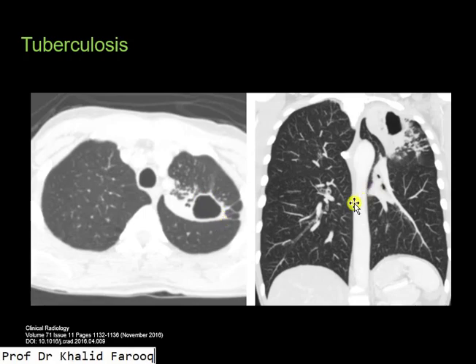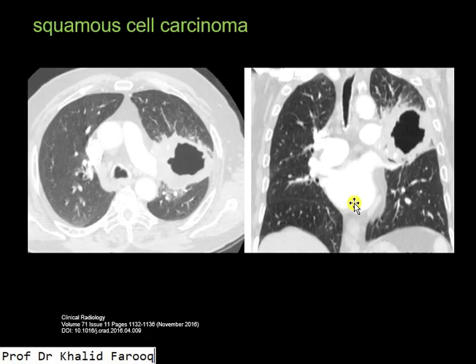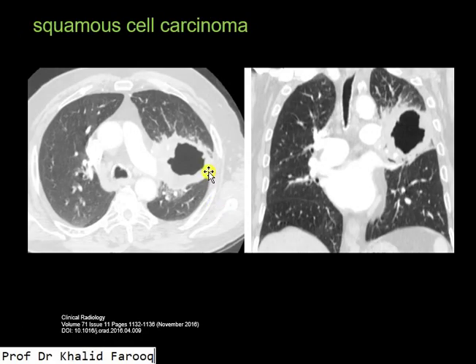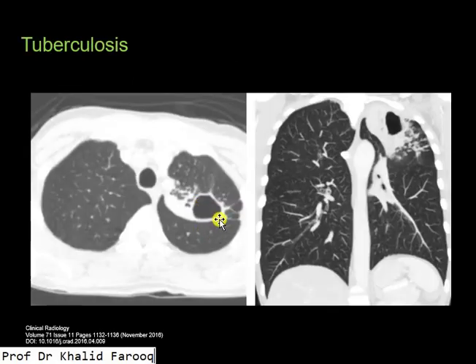The difference between these two lesions: here we can see this is a thin-walled cavitating lesion, while here we see irregular asymmetrical wall thickening of this cavity, which is a hallmark for malignant lesion. In the benign lesion we have seen a very thin and smooth-walled cavity in the left upper lobe.